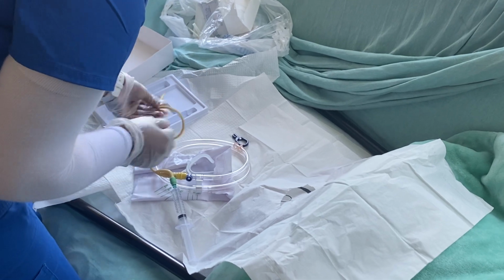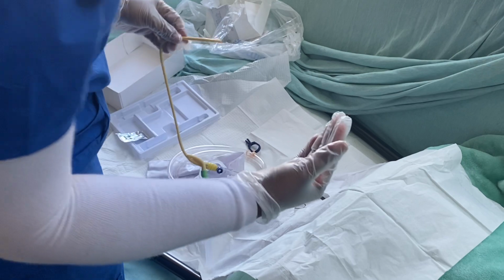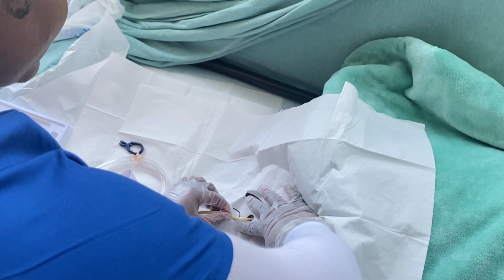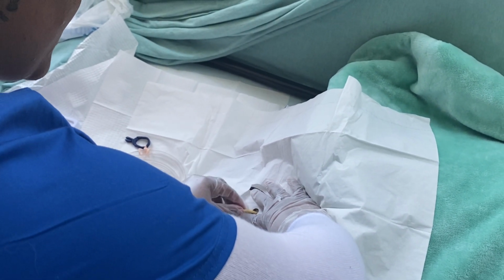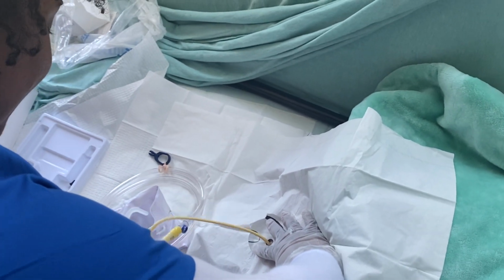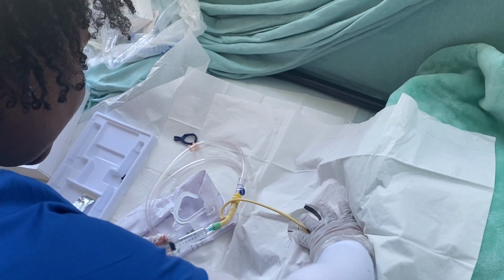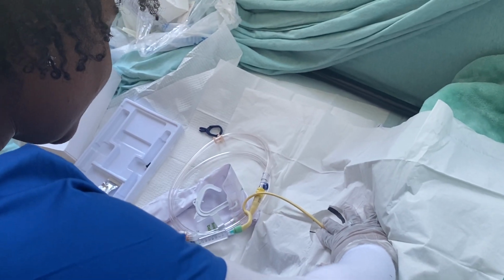And now, since I have lubricated the catheter, I want you to take a deep breath for me while I insert the catheter. And I'm gonna hold your labia, and I'm gonna insert. Inhale. Okay. Oh, everything is great. I see a little bit of urine. So now I'm going to push just a little bit more. I'm going to insert 4 milliliters of water to balloon it up.